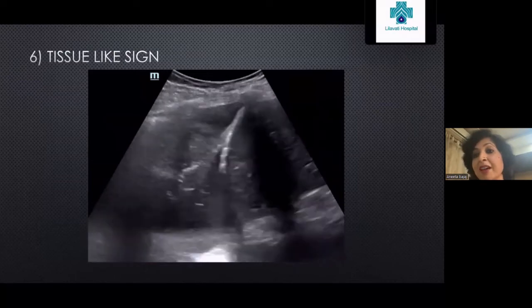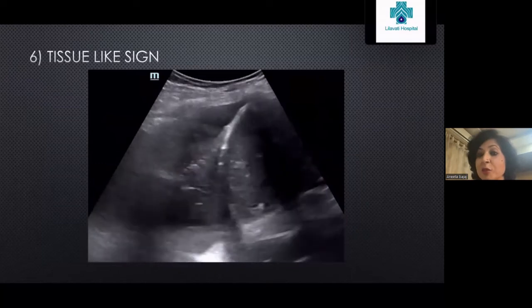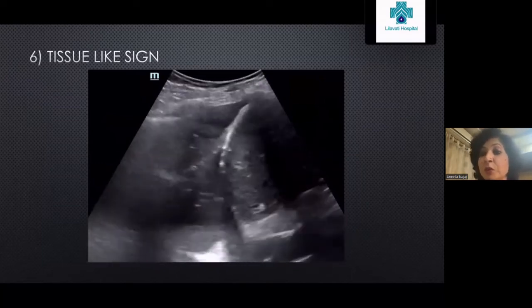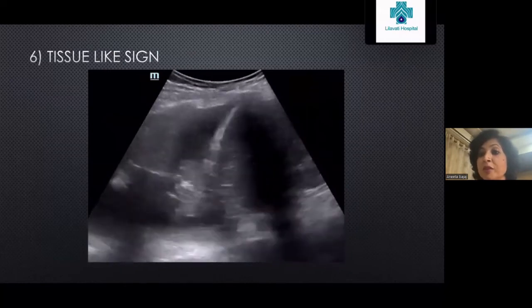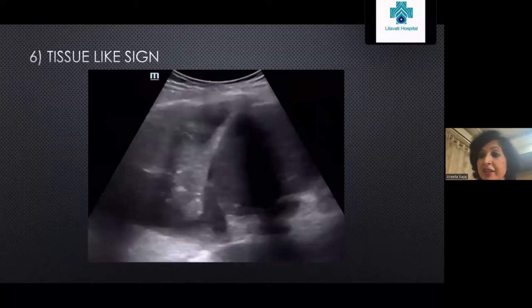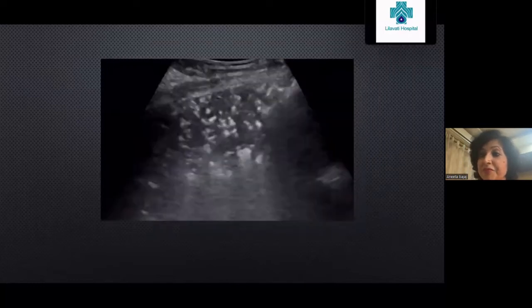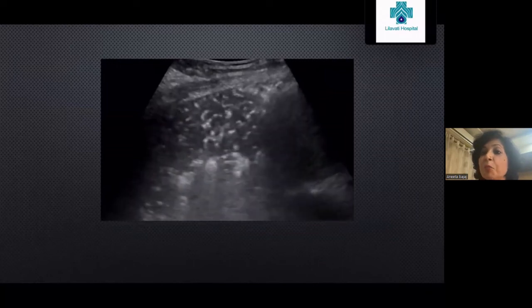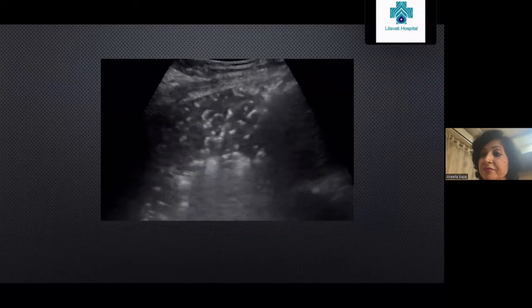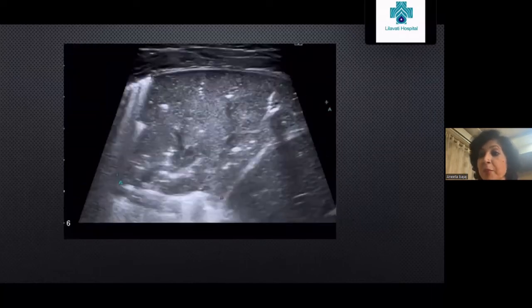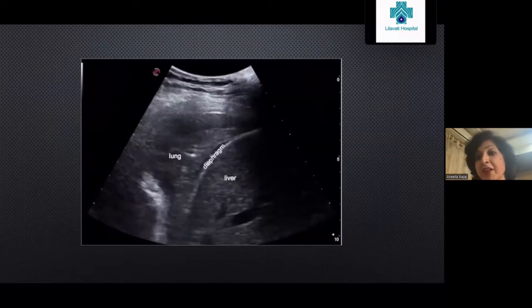The tissue sign means the lung looks like solid tissue, almost like the liver — this is called hepatization of the lung. You can see the air bronchogram at the edge. Related to this is the shred sign, which looks like a shredded cheese appearance at the interface between the consolidated lung and the normal lung. Consolidation appears as solid lung tissue with mobile air bronchogram, and effusion may also be present.